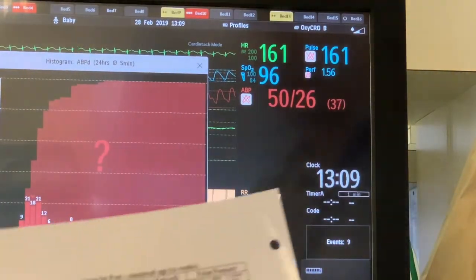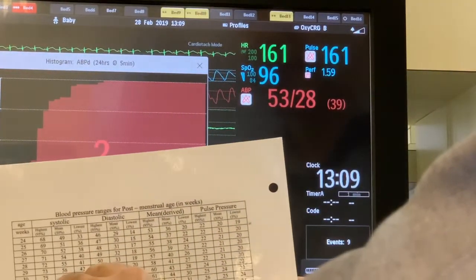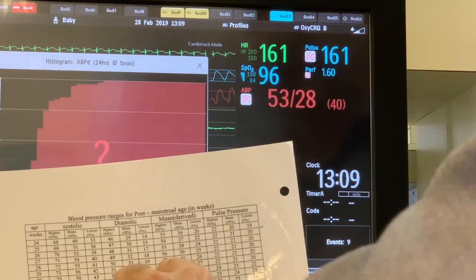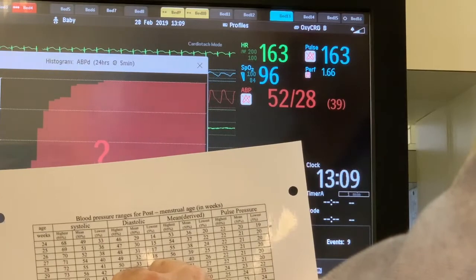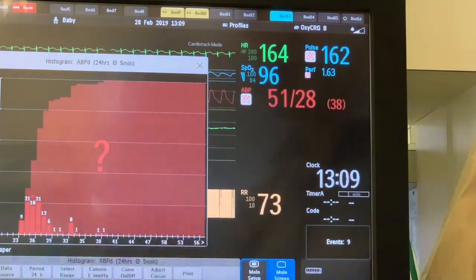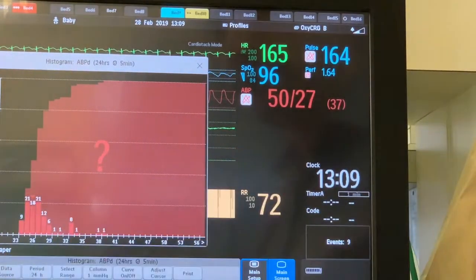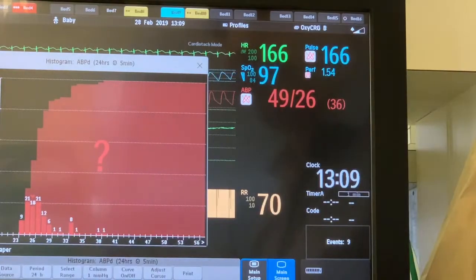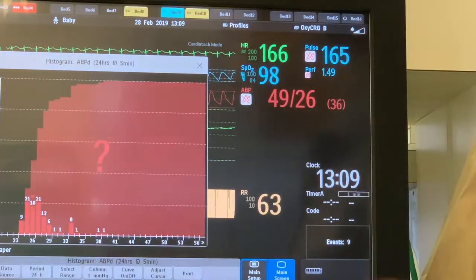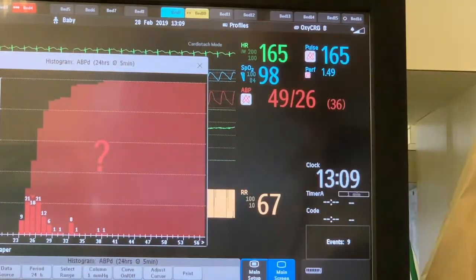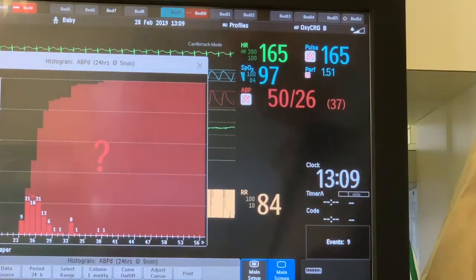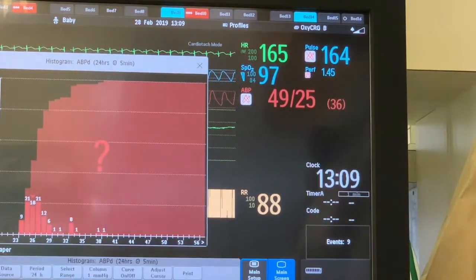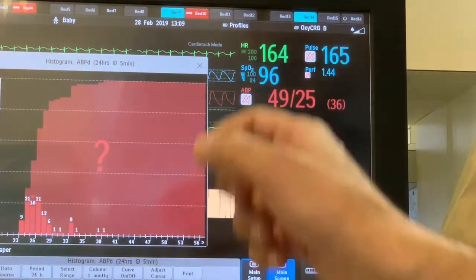For 28 weeks, the acceptable diastolic blood pressure is between 19 and 33 mmHg. The lowest diastolic blood pressure recorded was 22 mmHg or above. So diastolic blood pressure over the last 24 hours was acceptable for this infant. If the infant is on cardiovascular medication — either vasopressors or inotropes — this is the time to consider weaning cardiovascular support.